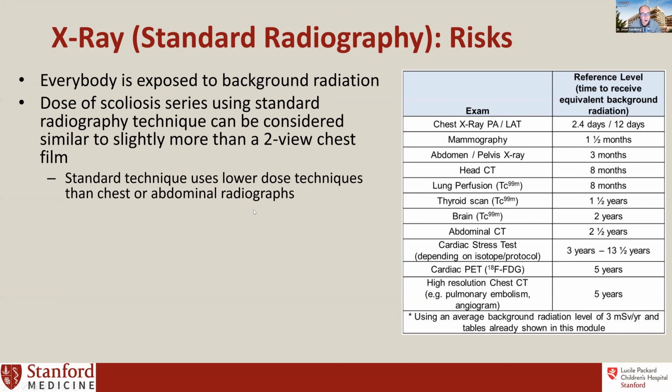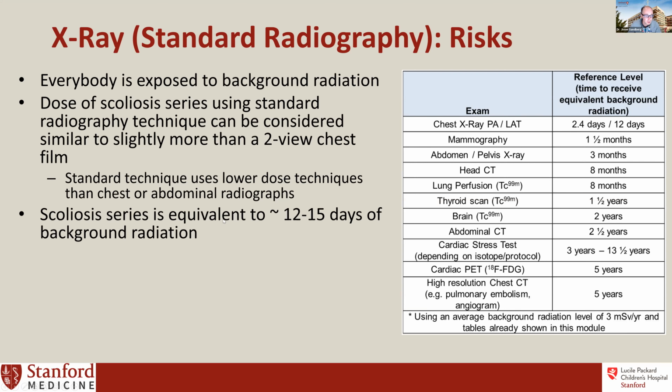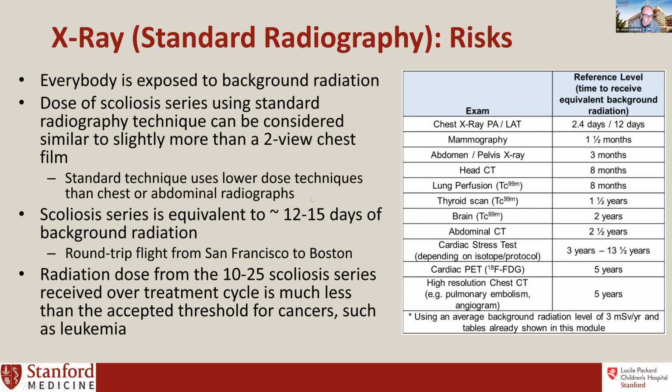Now, however, our standard radiography technique for scoliosis uses a much lower dose than a chest radiograph. So it is somewhat harder to predict, but you could think of it like that. Another way to think about it is a round trip flight from San Francisco to Boston. That's the equivalent of a 2-view chest radiograph, more or less. I think many people have traveled a long cross-country trip. That's the equivalent of a 2-view chest radiograph. And so that's basically what your child will receive.